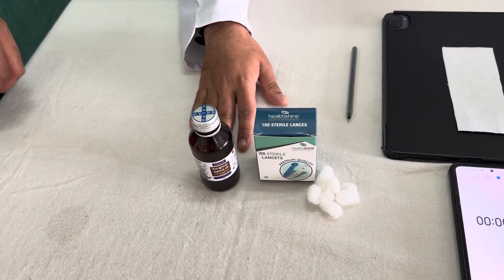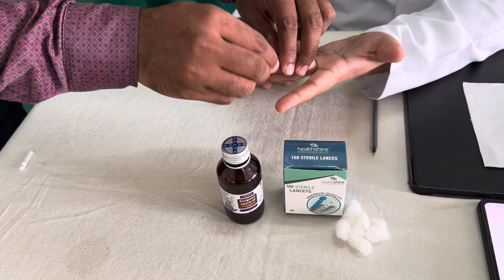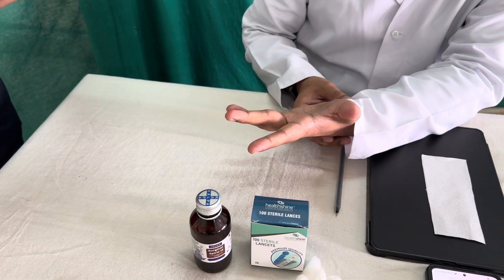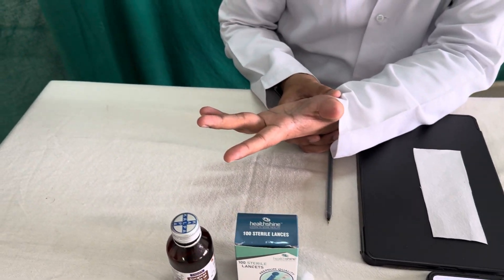Let us start the procedure; meanwhile we will discuss some theory points if possible. With aseptic precautions we need to first prick the finger, then immediately when you puncture the blood vessel, we have to start the stopwatch.